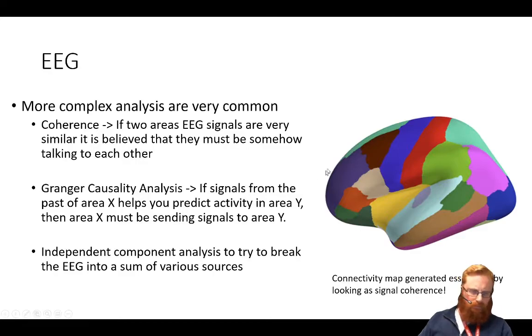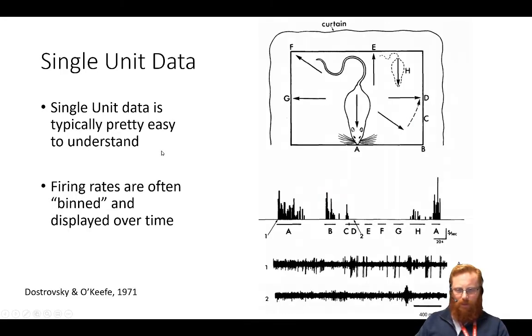And you can see that this matches very closely to some of the classical cortical regions: S1, M1, there's A1, there's V1, premotor regions. These will be the ventral stream areas down here. Point is, because the EEG signal itself is a bit hard to interpret, you need to look at more complicated measures to try and draw something from it.